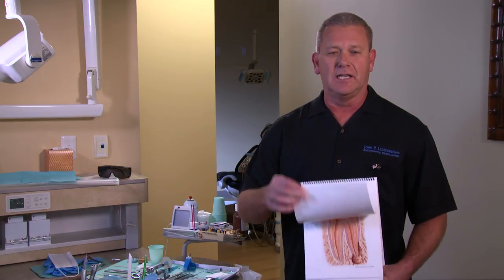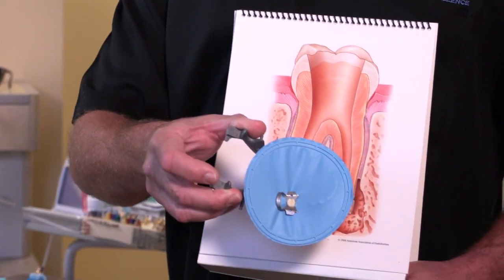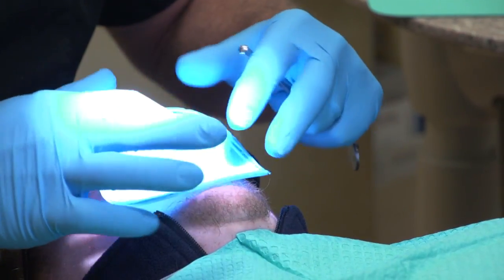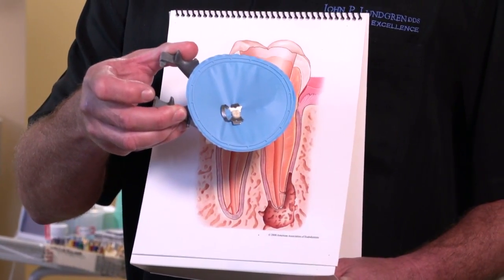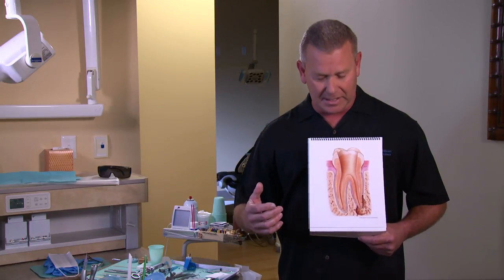So the only difference between a filling and a root canal is this. This is a rubber dam, and as you can see, it fits right around the tooth. It gives me a sterile field in which to work. You wear it like a little mask. And that's the only difference that you'll find between a filling or a crown and a root canal.